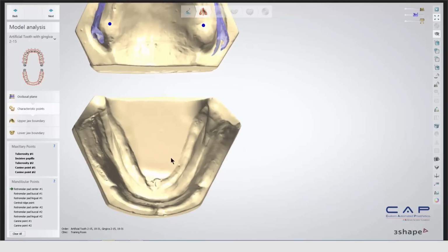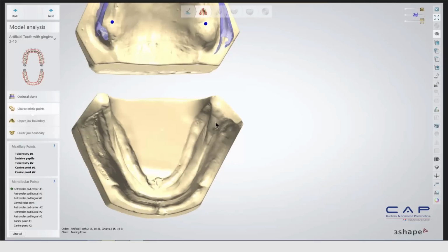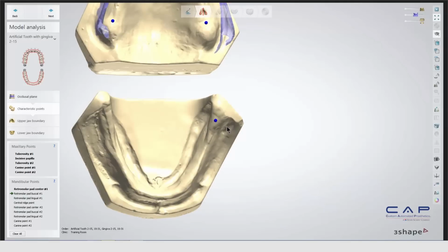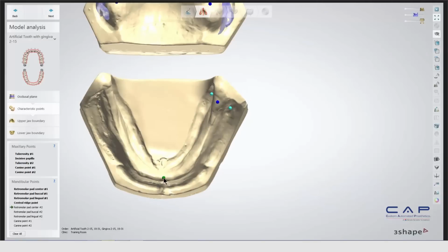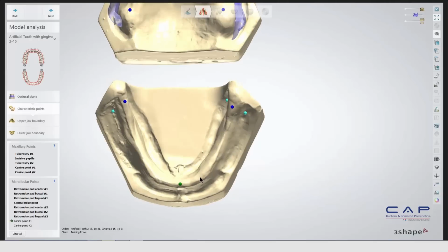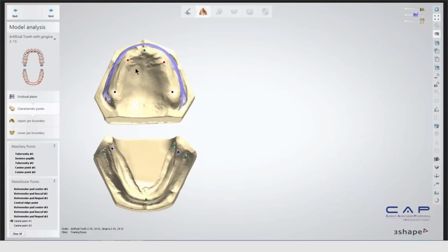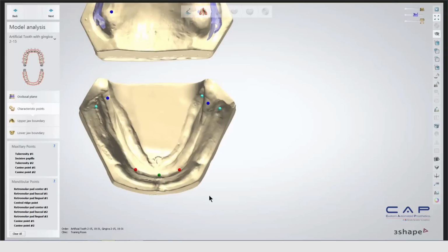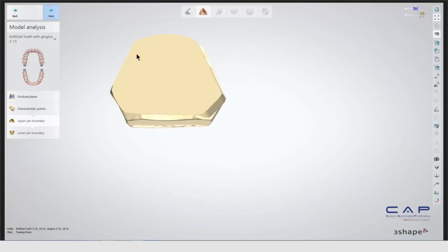On the lower, we want to be a little bit more individualized with our characteristic points. We're going to start with the retromolar pad, which is right here, and then we're going to mark on the buccal and then the lingual portion of that. So we want to mark on those extents as far as we want. Then we're going to do the central ridge point. Do the same thing on the other side as well: retromolar pad, the buccal, and then the lingual points. Now we're going to mark our canines, which we can't really align these two together here, so we're just going to go off based off of these instances. Just going to go there. Once we have all our characteristic points set up, let's double check to make sure they're okay, and we're going to go on to the next stage.